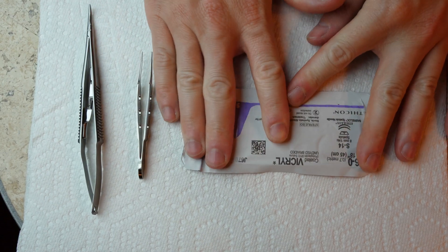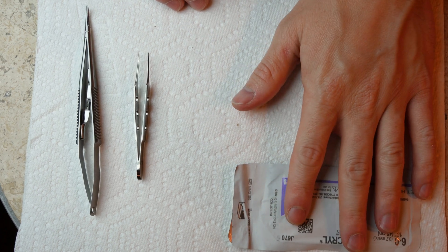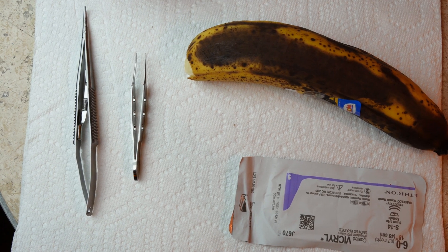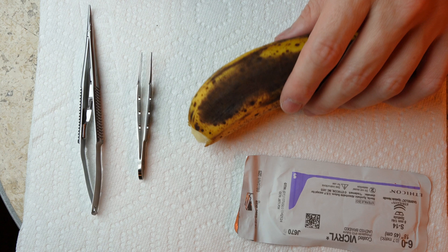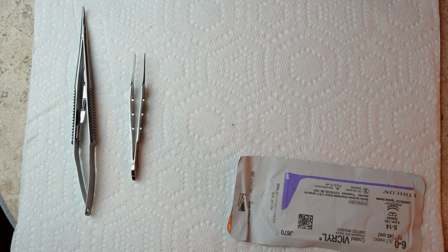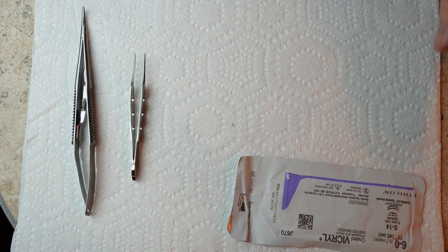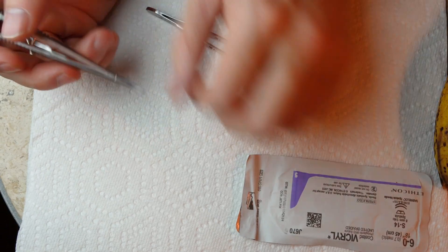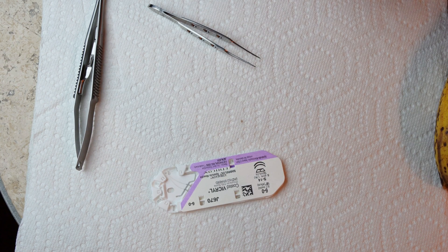You'll need some suture — see if you can borrow some from somewhere. I've got some vicryl here, 6-0 vicryl on an S14. It'll just be a little easier to see the suture. And if you get a fruit of some sort, you can use an orange or a banana to practice suturing on. If we're talking about doing eyelid skin, an orange is going to be a little bit too thick — that may be more close to brow skin. If you get something a little bit thinner it'll be more approximate. The main thing here is we're just practicing using the instruments, how to hold them, how to load a needle, just the basics.